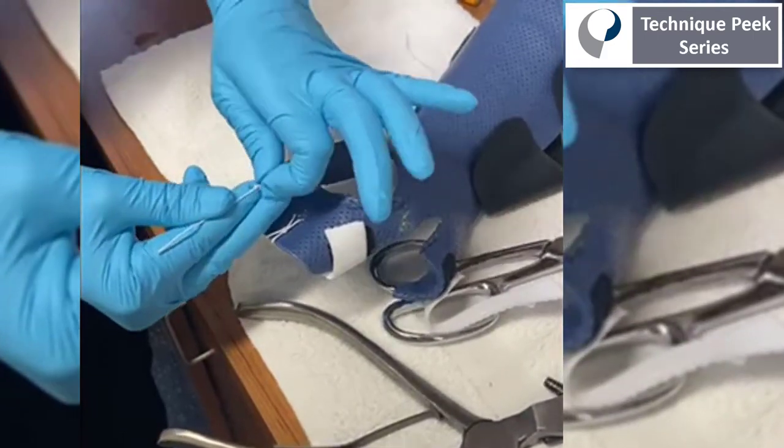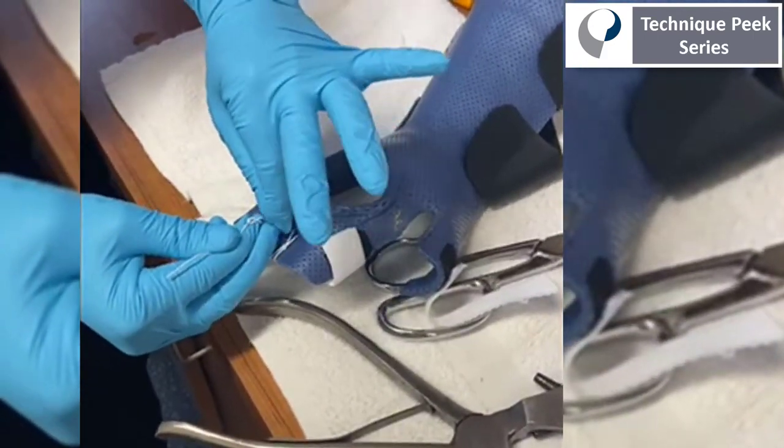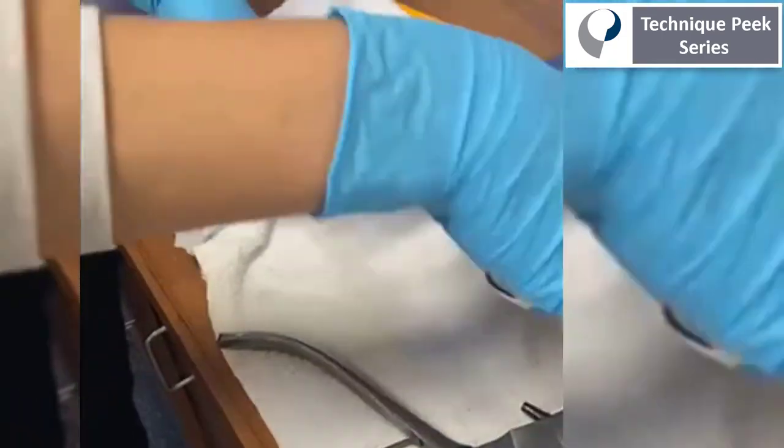I'm using an elastic cord to tie the straps as well. It's important that both the strap and the cord be elastic, because that's the part that allows for active flexion.